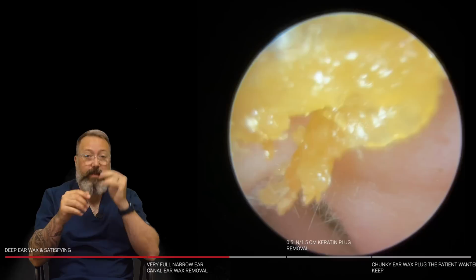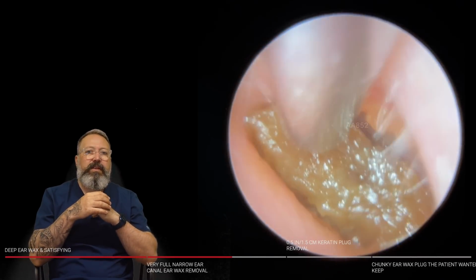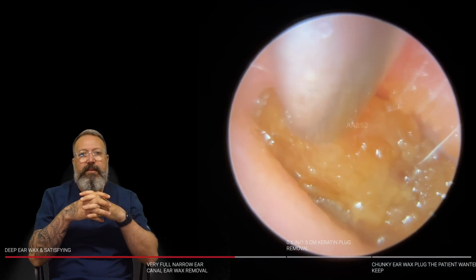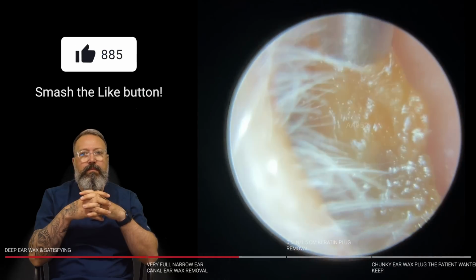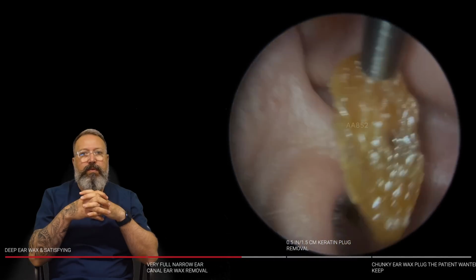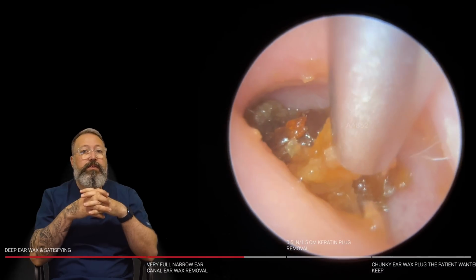Okay, so we're getting this bit out now and you can see a little bit of a softer material on this side, slightly wider canal as well, which makes our job just a little bit easier. Out this is coming. There we go. All the way. And let's take a look beyond that. A bit more in there. So this one's a fuller ear canal. Now the other side had the small bit.